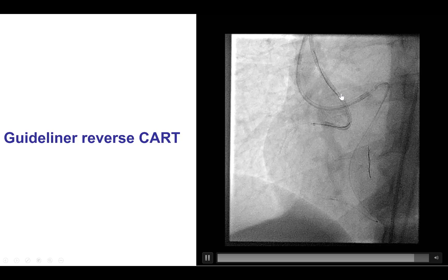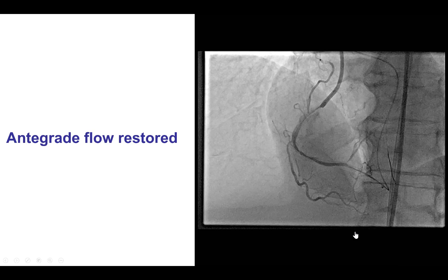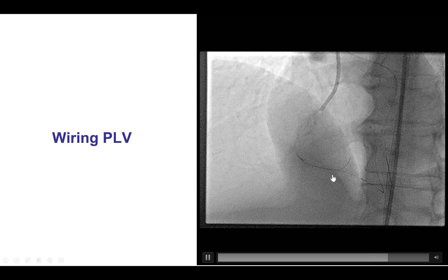The wire was trapped into the guide, and then the Turnpike LP advanced, followed by externalization of an R350. Balloon angioplasty was done, restoring antegrade flow. There was disease in the posterolateral branch, and that is why that branch was wired. A kissing balloon inflation was then performed.